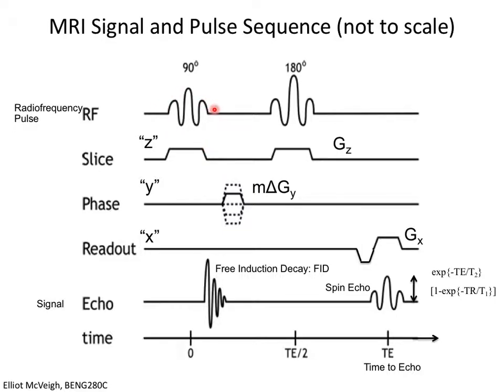So the hips of the patient are resonating at a different frequency than the shoulders if the patient is lying along the Z-axis. And what that does is, if I have a constant gradient on during my RF excitation, only one single axial plane of the patient is actually on resonance.